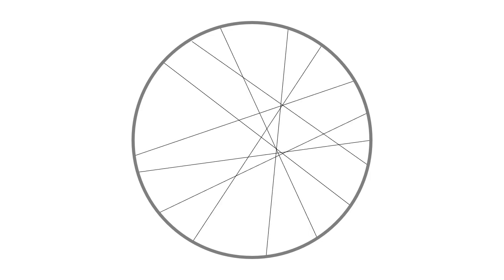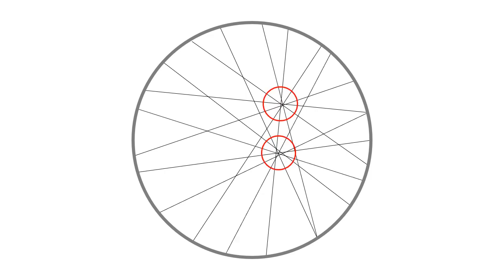as all we know is that somewhere along this line, a positron annihilation occurred. But if we start getting multiple points and multiple coincidences of these 2 detectors going off at the same time, we can start to build up a map, and where we see these lines overlap, we can say, hey, most likely this is where our positrons were located and where they annihilated.